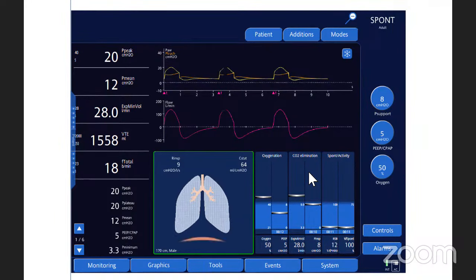Thank you, Dr. Khairallah. What I can understand is that the ATC will provide more tailored support to the patient depending on the tube and the flow. But outcome-wise, is there any difference? Is it more physiological and comfortable for the patient to go to ATC by comparison to the classic pressure support? Or is it, by the end, the same as long as you choose the proper support in the pressure support settings?